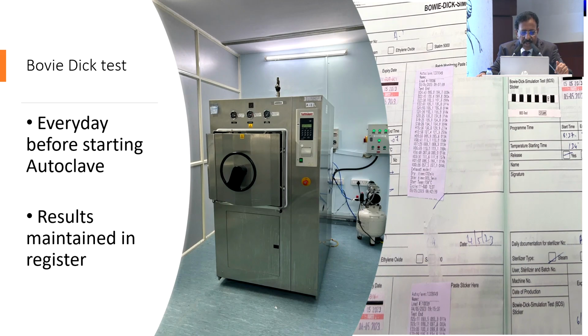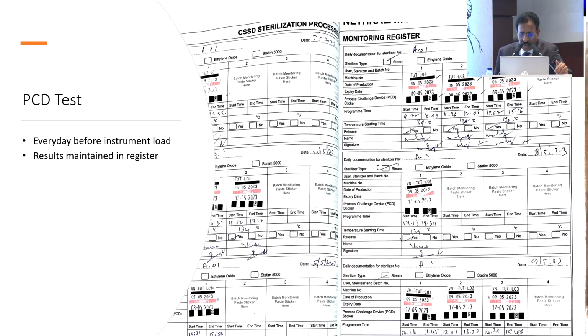The Bowie-Dick test is used before starting the autoclave to ensure that the machine is working well and the process is going through, and the results are maintained in the register. Many of the newer machines give a printout that can be stuck to the register.